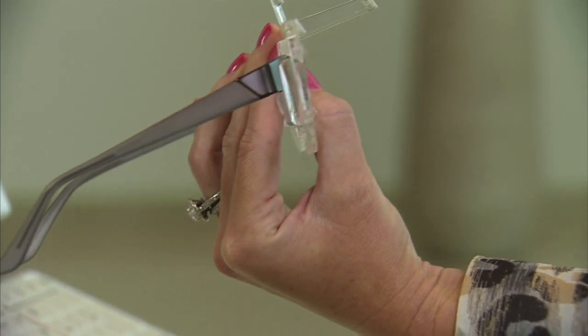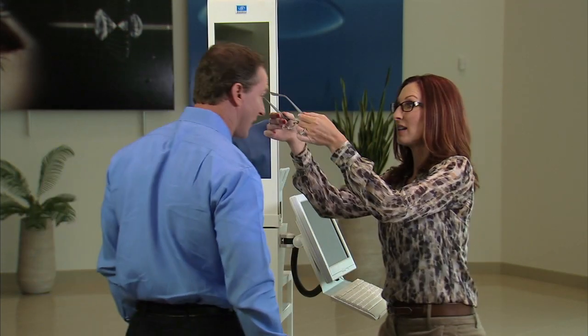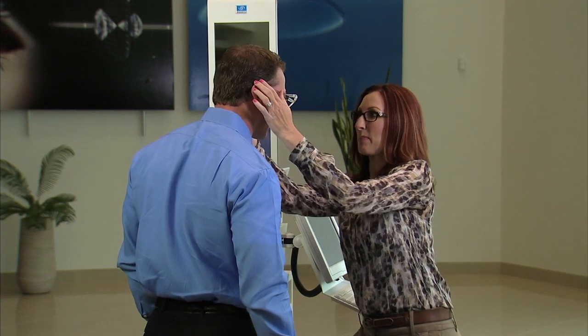Once the patient has replaced the frame, check again the comfortable and correct position of wear before beginning the measurement process.